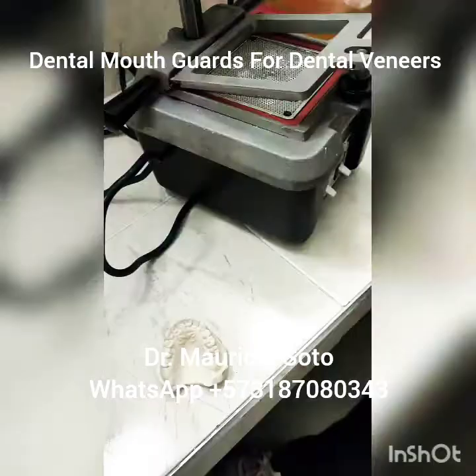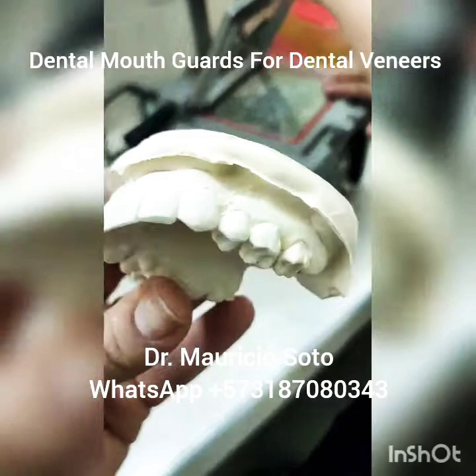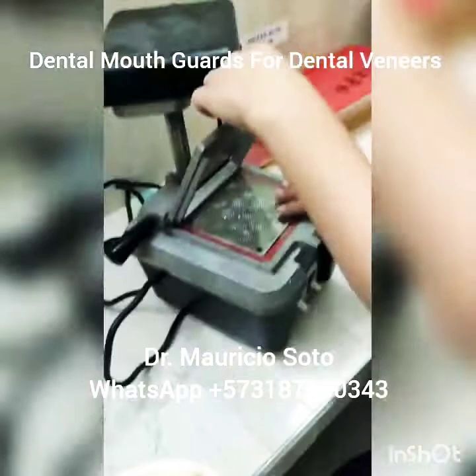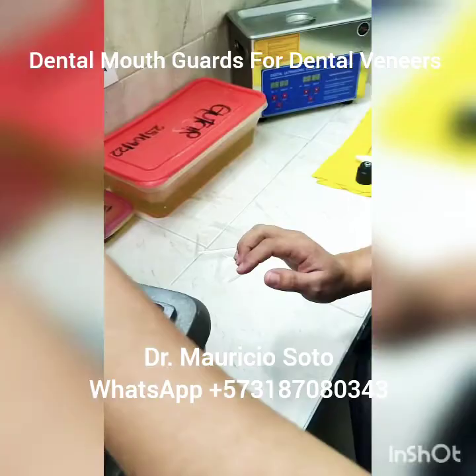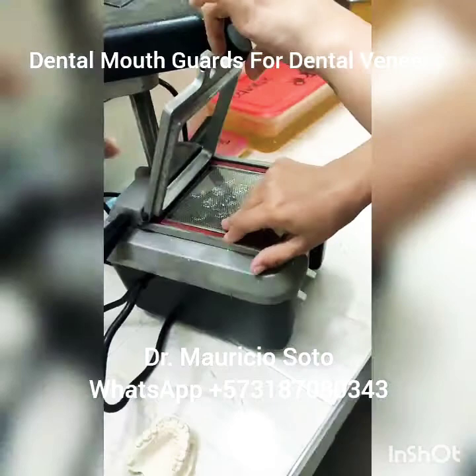When we remove the stone from the alginate, we have this — a great model without bubbles. Now we're going to use our vacuum machine. We put a plastic of one millimeter for the flap. With this vacuum machine, we heat the plastic and do the night guard.